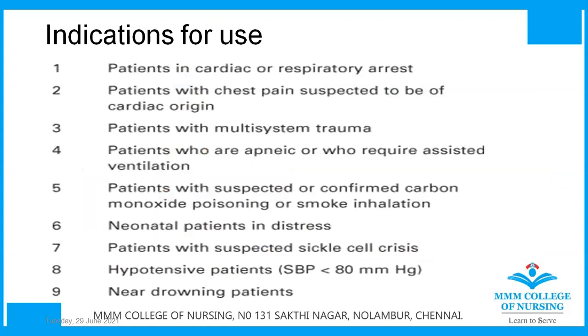Indications for use are patients in cardiac or respiratory arrest, patients with chest pain suspected to be of cardiac origin, patients with multisystem trauma, patients who are apneic or who require assisted ventilation, patients with suspected or confirmed carbon monoxide poisoning or smoke inhalation, neonatal patients in distress, patients with suspected sickle cell crisis, hypotensive patients with systolic BP lesser than 80 mm of Hg, and near drowning patients.